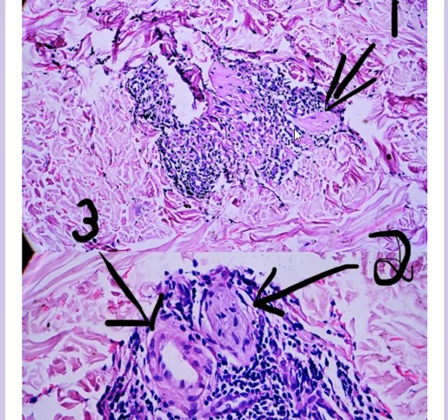In the mid dermis, superficial dermis, what you're seeing more of is the arrector pili muscle. It has a much more eosinophilic cytoplasm, the muscle cell, and the nuclei are not as wavy. The nuclei are much more short and straight. Okay, here the cells are more spindly. You can see here there's a wavy nucleus, and the cytoplasm is relatively less compared to the nuclei. Here, for this amount of cytoplasm, there's 2 nuclei here. That's it. Okay, so this is how you differentiate between a muscle and a nerve.